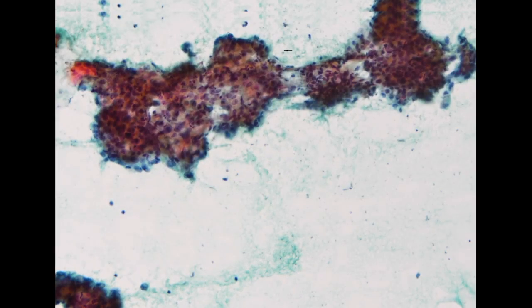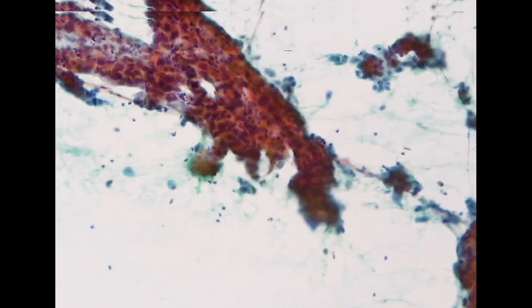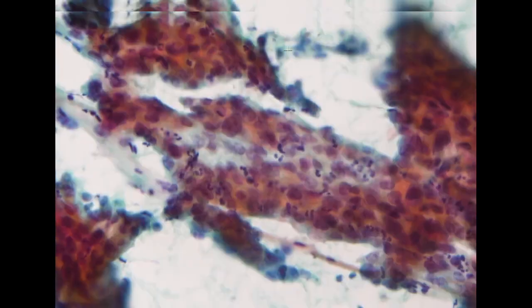So this is positive for adenocarcinoma. The smear preparation is not ideal, possibly because of some pigmentation of the bile. But we can demonstrate a highly atypical three-dimensional glandular cluster with unequivocal nuclear atypia. So this is considered positive for adenocarcinoma.